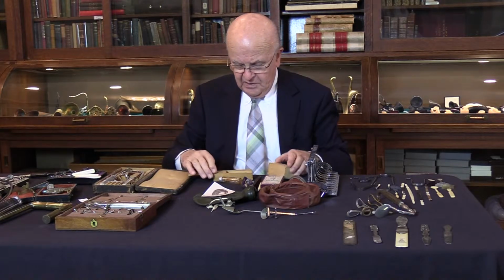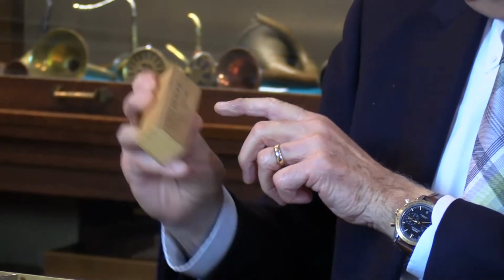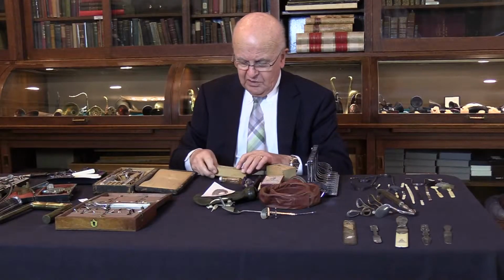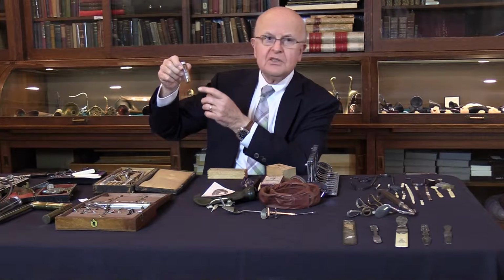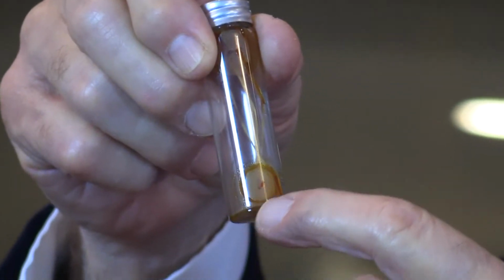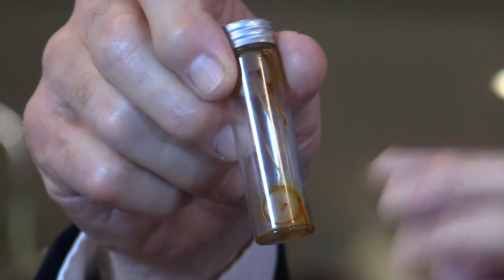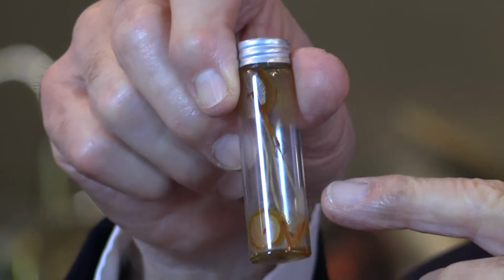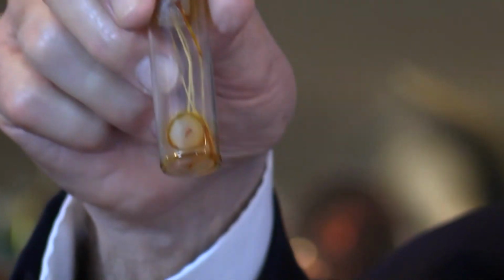And this is another one, and they were produced in Detroit, Michigan. And it's very clever. I don't know if you can see this well, but it looks like an eardrum here, and what they did, they inserted this on the eardrum to cover the hole, and there is a thread coming out in case you want to remove it.